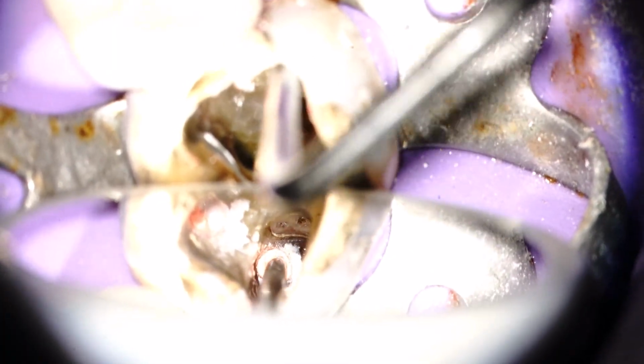So I use the gutta-percha gun to backfill, and I bring it right up to the orifice of the resorption defect area, not wanting to really get it into the bone area at all. Compact it. Now I'm going to fill the distal canal like we normally do. A supplemental cone to keep the cone from collapsing, and the same sequence.